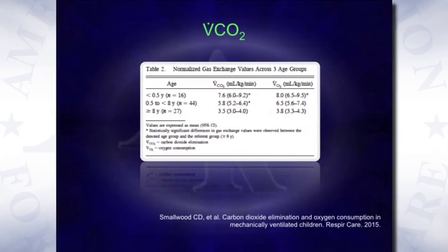And really my motivation for doing this was to make as simple a tool as possible for us RTs and physicians to be able to look at the VCO2 level at the bedside and immediately know whether or not that was dramatically higher or lower than expected, which could lead to some interesting hypotheses or potentially treatment modalities in our patients. So let's look at these ranges.